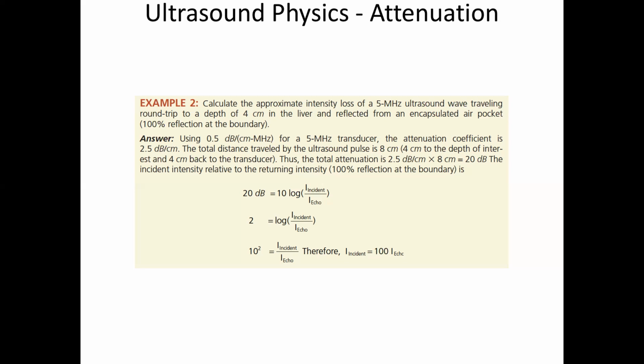We just turn up the gain on the transmit. It's like, make it louder, turn it up to 11. So we just increase the gain on the transmit, and then it'll give us an increase in what is received. But we can't do that forever, right? Because one, we probably just have a peak gain that our crystal can put out in terms of peak amplitude for ultrasound.